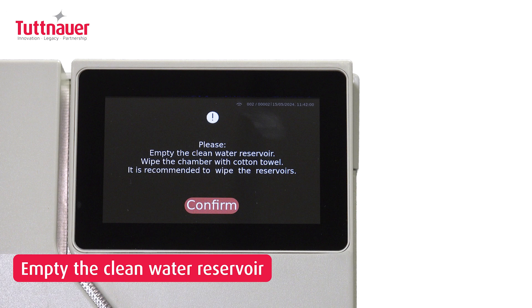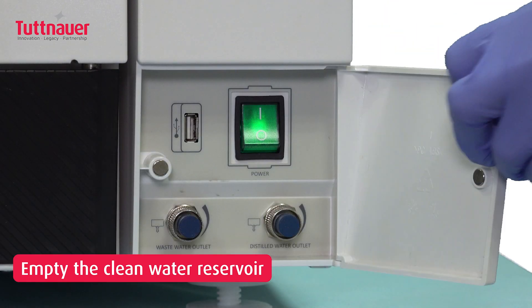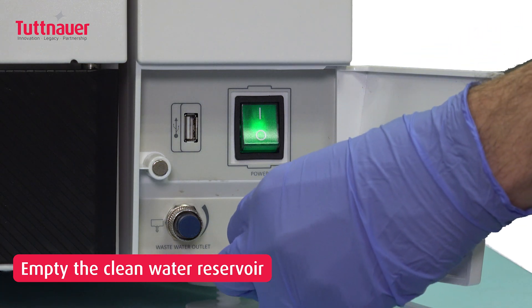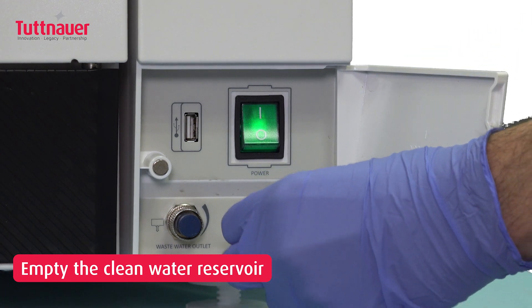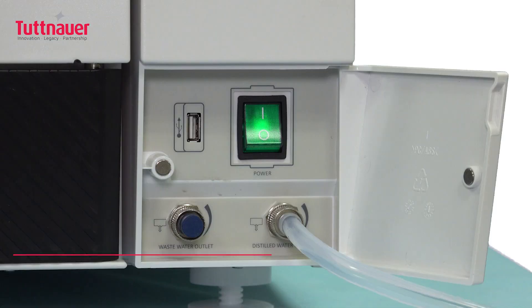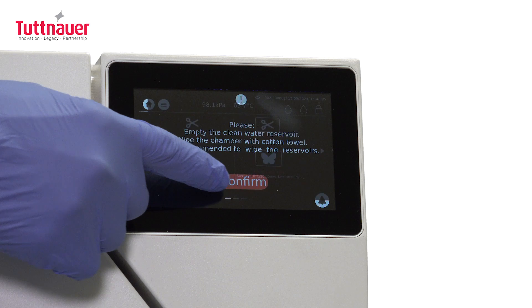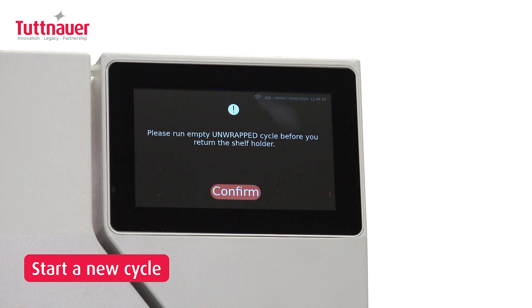Empty and refill both water tanks. Wipe the internal chamber walls. Place an empty tray in the chamber and run a new cycle to remove any chemical residue.